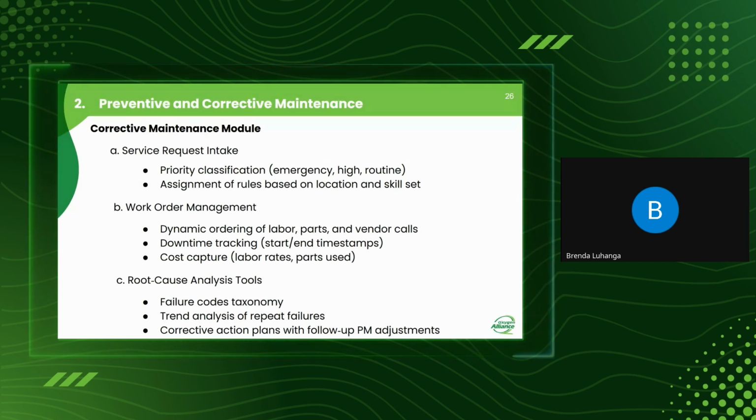And on the other question by Johannes, the difference between model list and medical device development plan. So a model list is simply a list of all medical devices that you have in your facility, while the medical device development plan is a document that illustrates how your facility is going to acquire the medical equipment, how they are going to maintain it, or if there will be any need of replacement, how they will also replace it or decommission it.